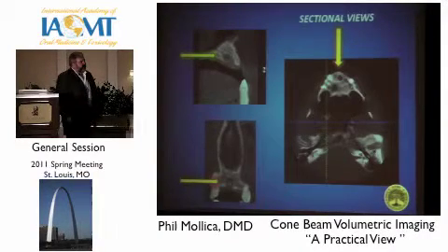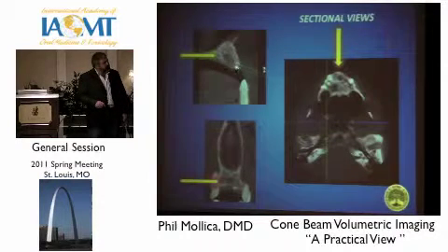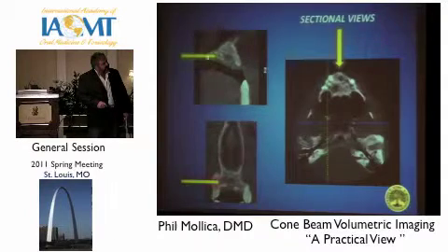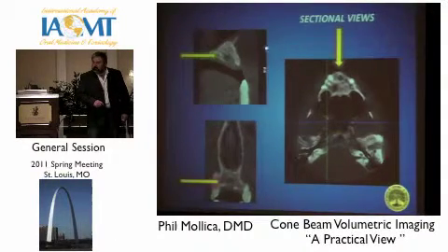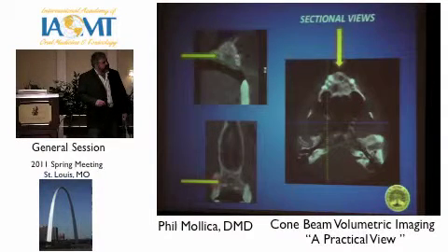Whoa. We start going through sectional views. All of a sudden, behind this edentulous maxillary area, I see this large lesion develop right here. And what is this right here? Incisive foramen. Okay, the incisive nerve coming down here. So I see this large hole here.